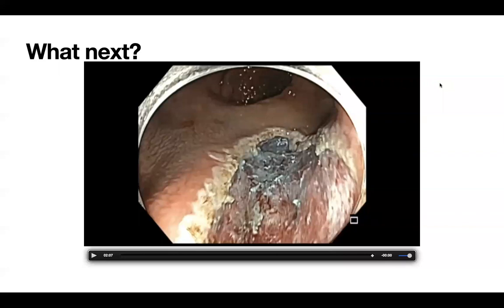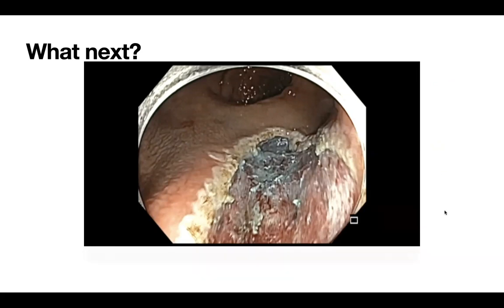All right, Joseph, would you ablate or not ablate? Yeah, I agree with Sriram's comments so far. Yes, I would ablate, both edges and probably near the hemorrhoidal plexus or at the hemorrhoidal plexus. All right, and Selvi?